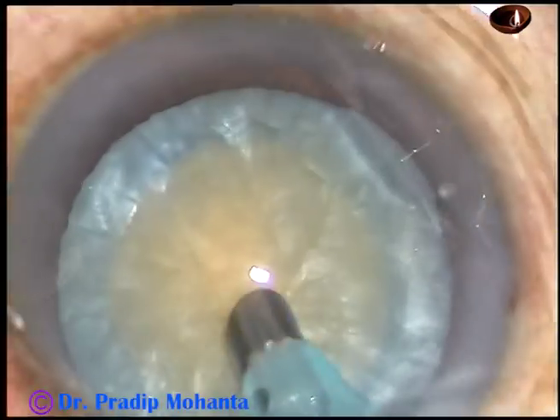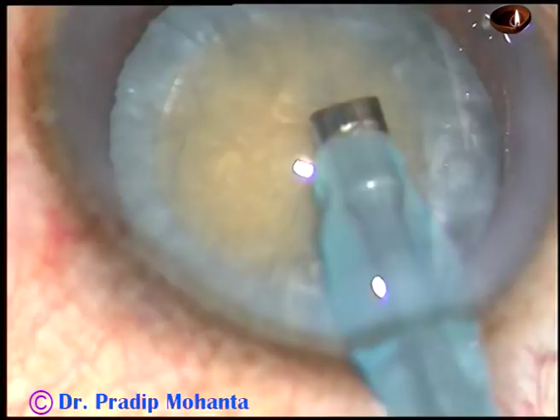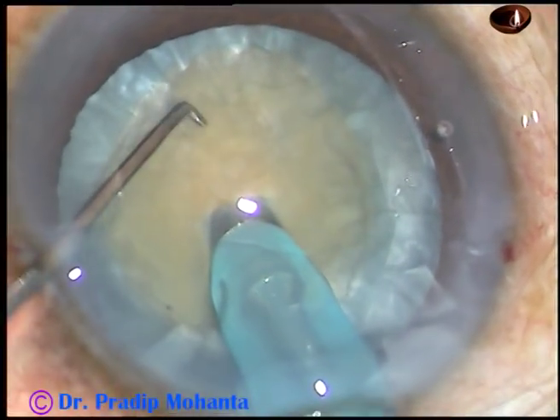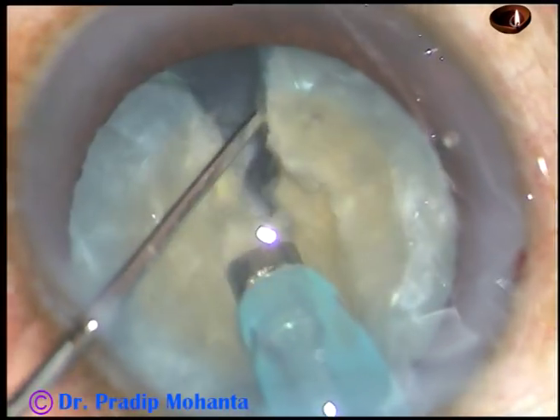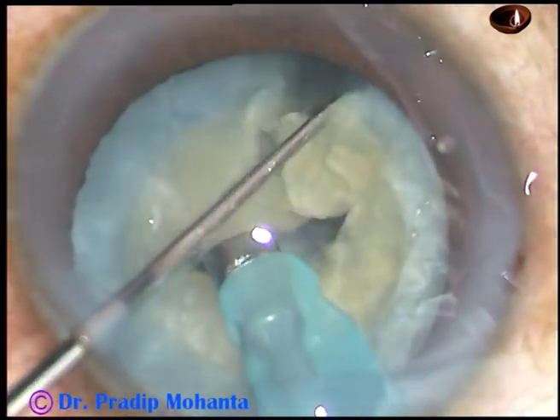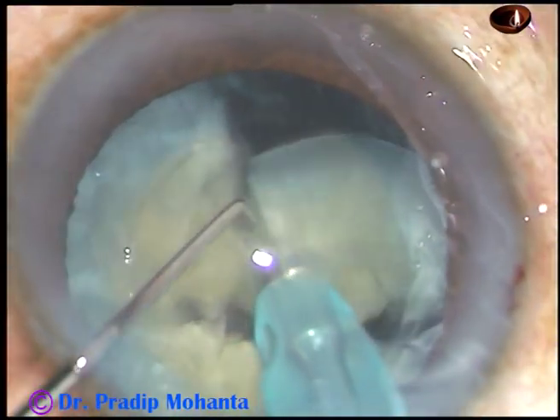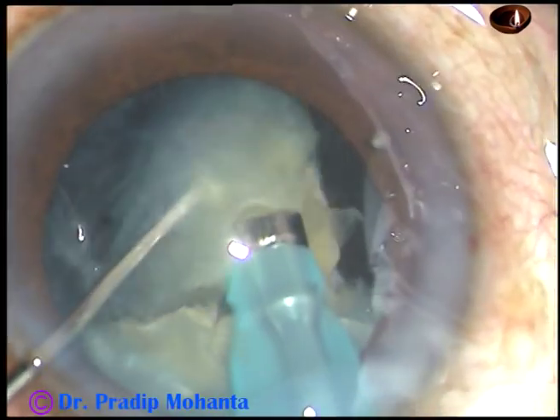Now the rest of the surgery is straightforward. I just do direct chop for this kind of cataract. Bury the tip, go for a distance, hold the nuclear mass very firmly and divide it. Rotate it, chop at another place. This is the other hemi-nucleus — it is held and chopped. So the nucleus has been divided into 4 fragments; each fragment is emulsified with ultrasonic energy.